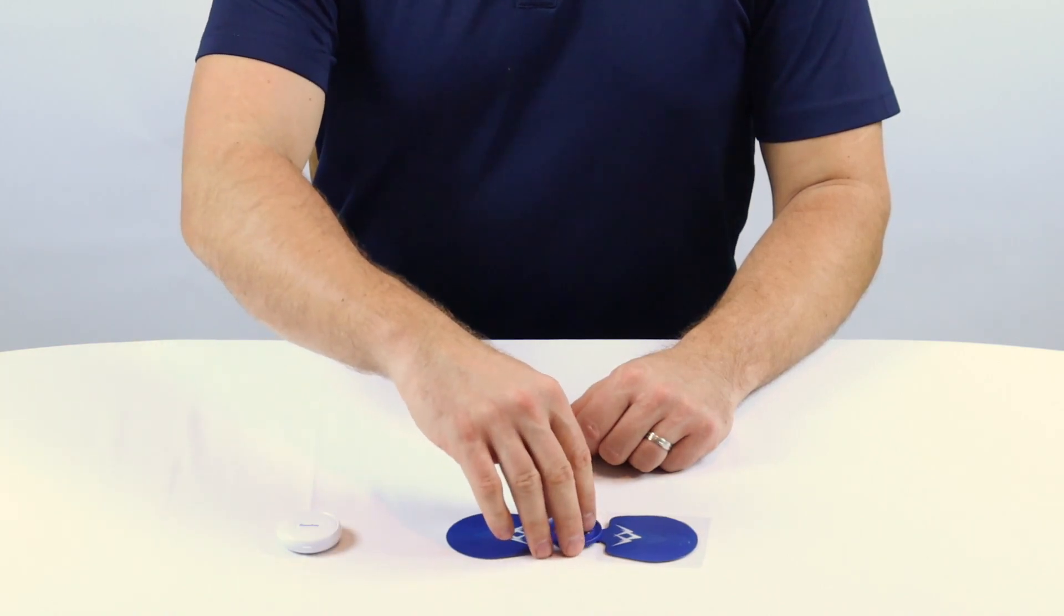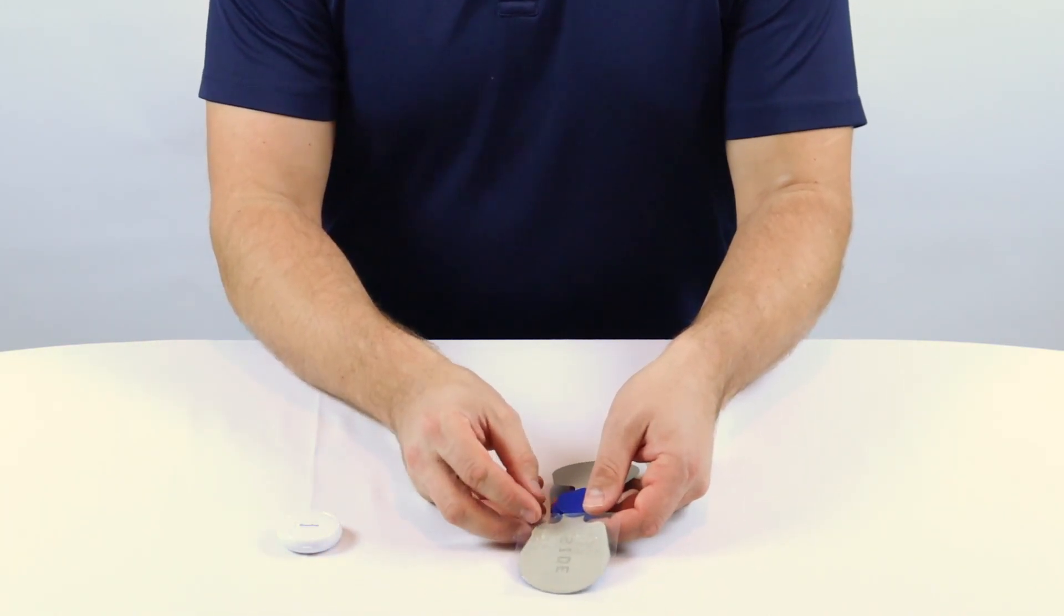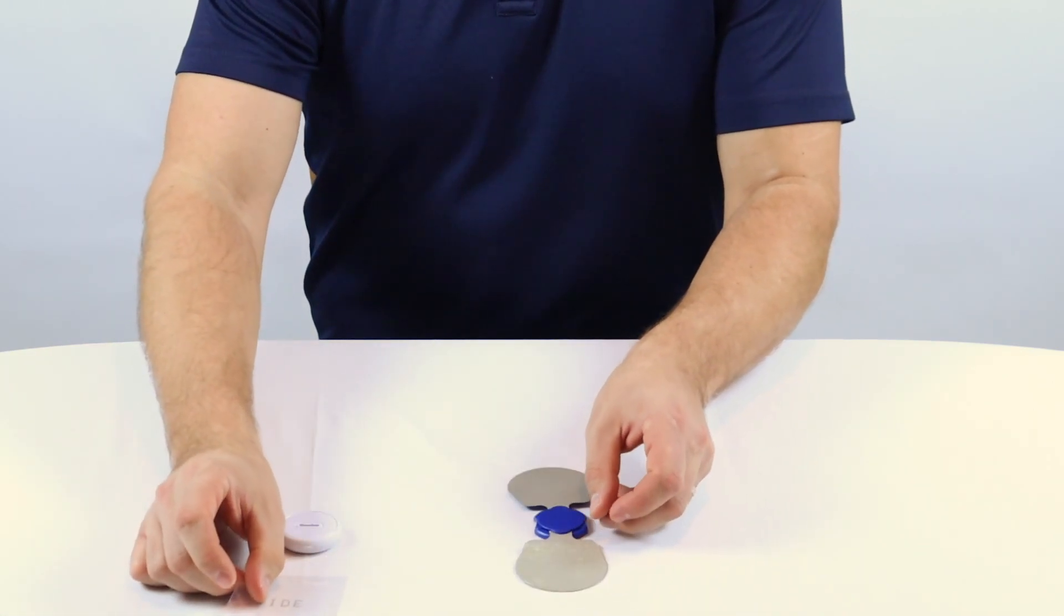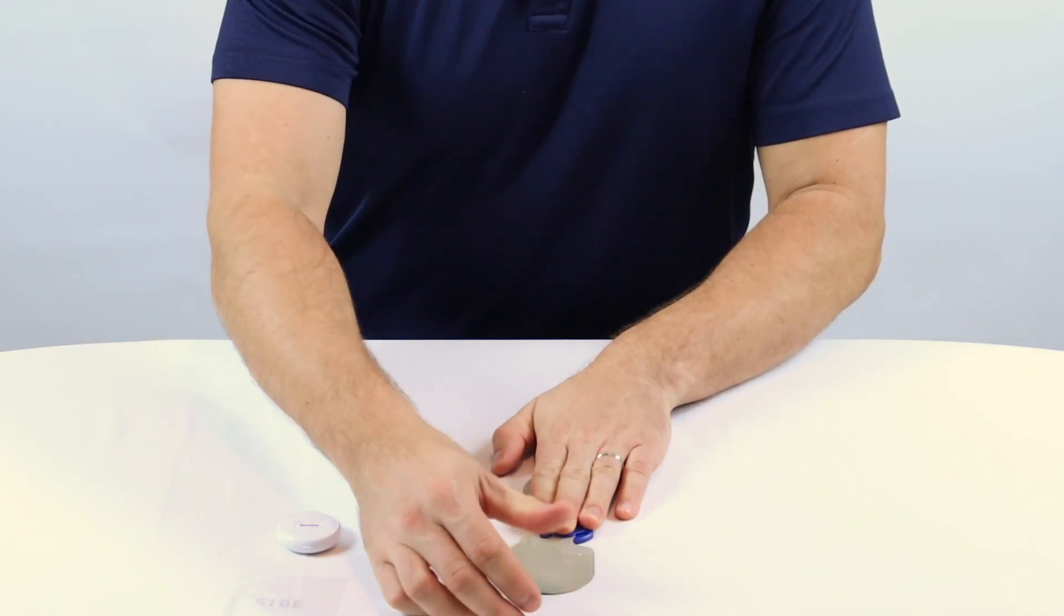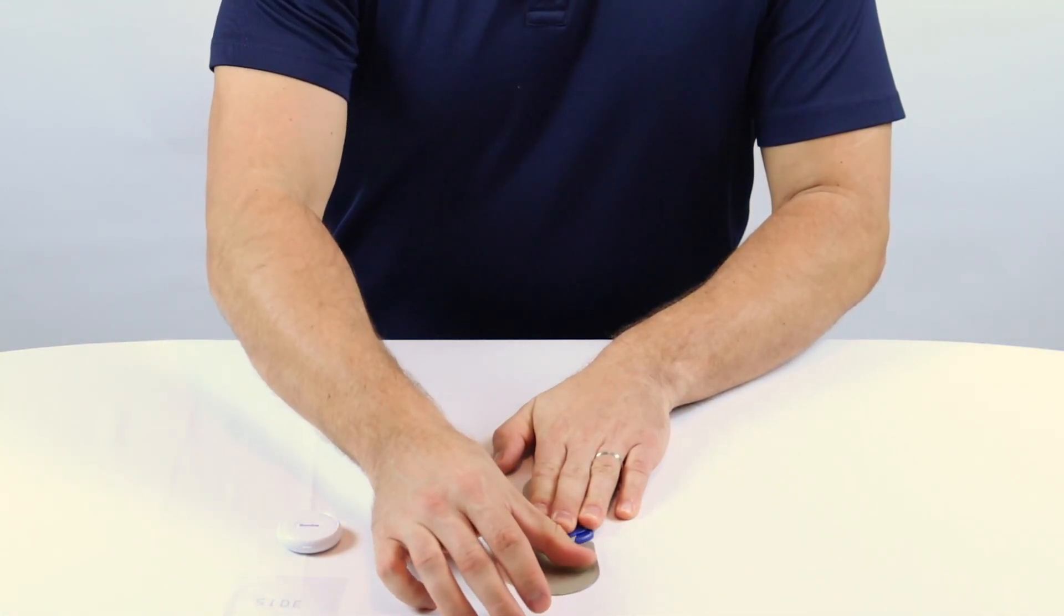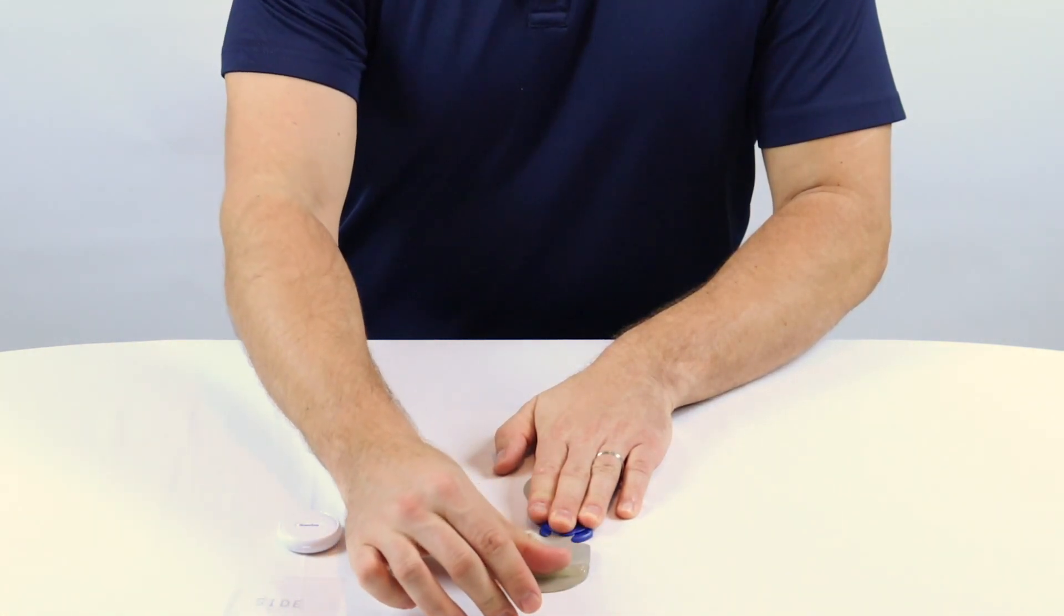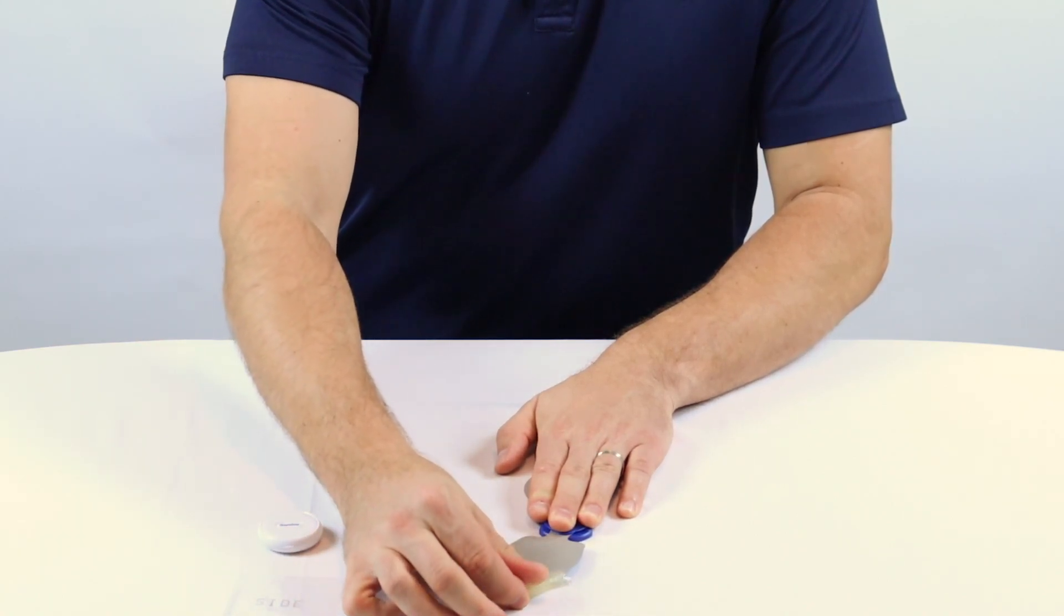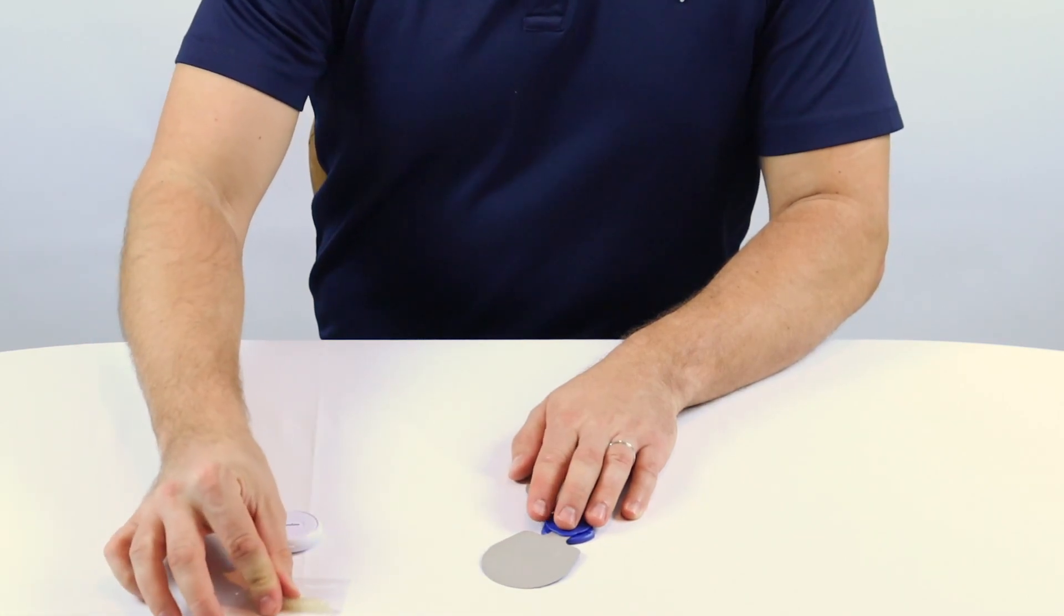The technique that we suggest for removing the gel pads is rolling the gel pad off of the wing. Do this by placing the wing gel side up on a table and holding it steady. Remove the plastic cover from the gel pad you want to replace and keep it for later. Then, from the end closest to the blue tab, roll the gel pad over onto itself until it's a cylinder at the wing tip and pull it off. Place it onto the plastic that you removed earlier.